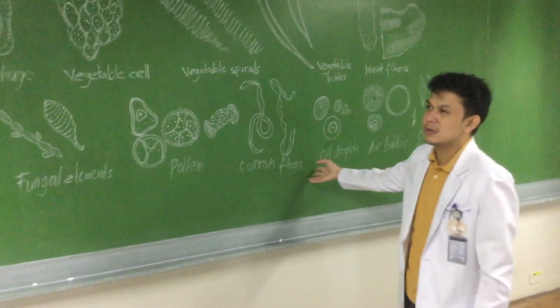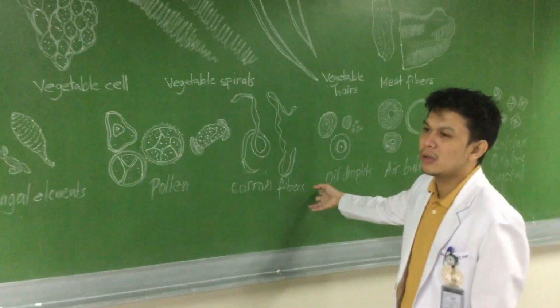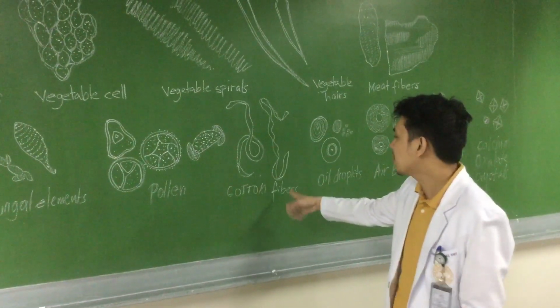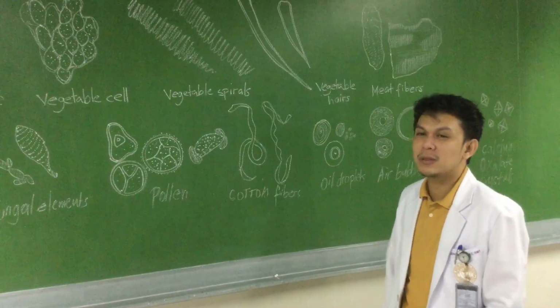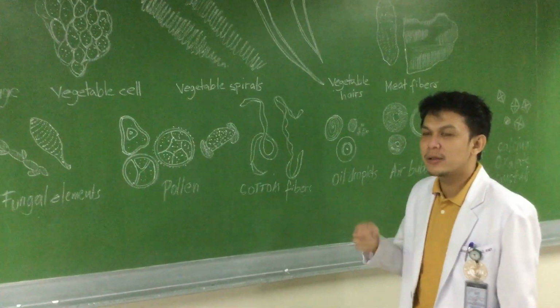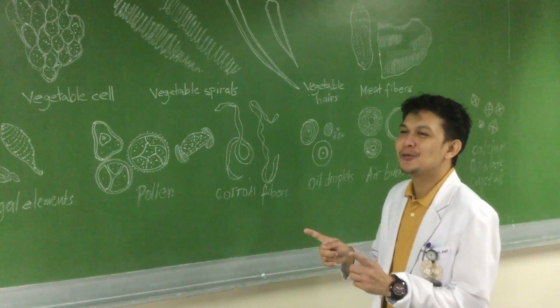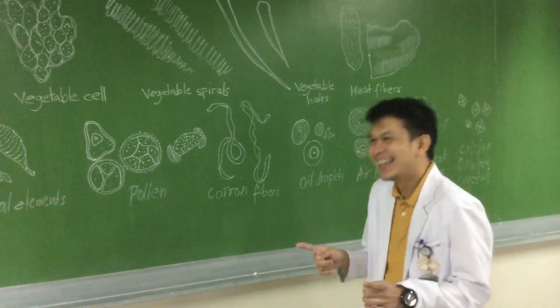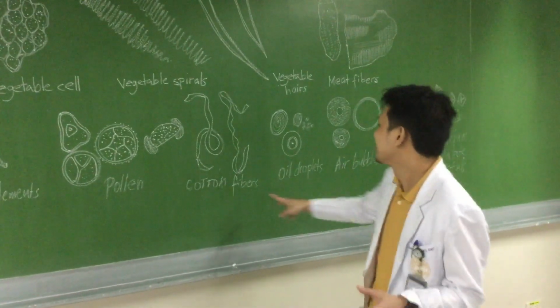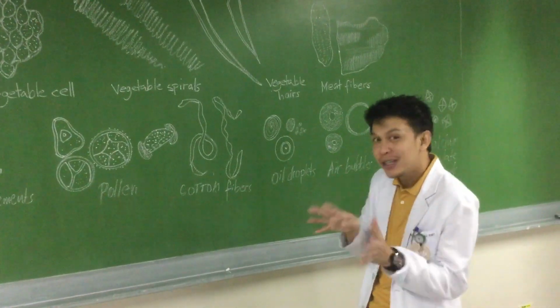Cotton fibers. Bakit nagkaka-cotton fibers? Sometimes kasi the patient will use cotton, yung pangkuha nila, yung cotton swab. That's why more often than not, may nakakasama cotton fibers. That's why it's not advisable. Usually, applicator stick ang pakuha niyo yung middle portion ng stool. Eh sir, paano kung water yung stool? Paano yung middle nun? Bahala na kayo, paano kayo kung nagrekta ng water stool? So, ang ideal kasi kung buo yan, yung middle part, morning stool.